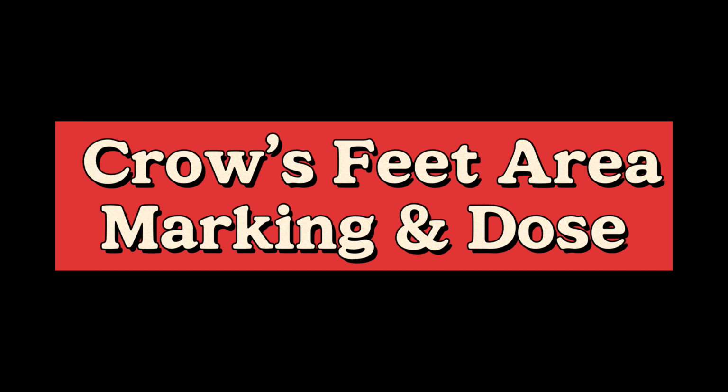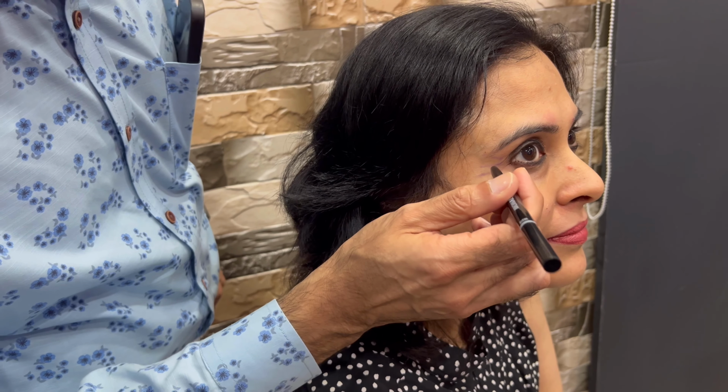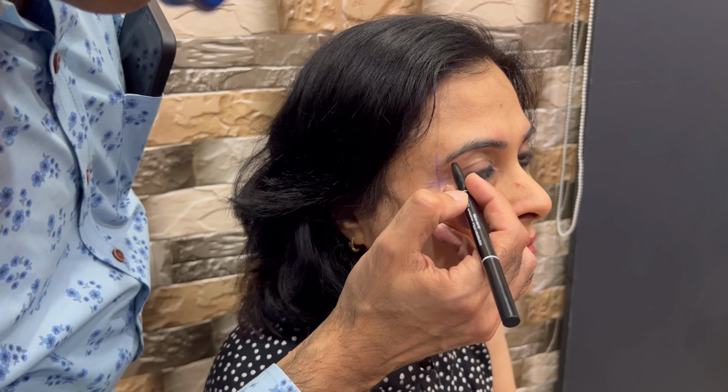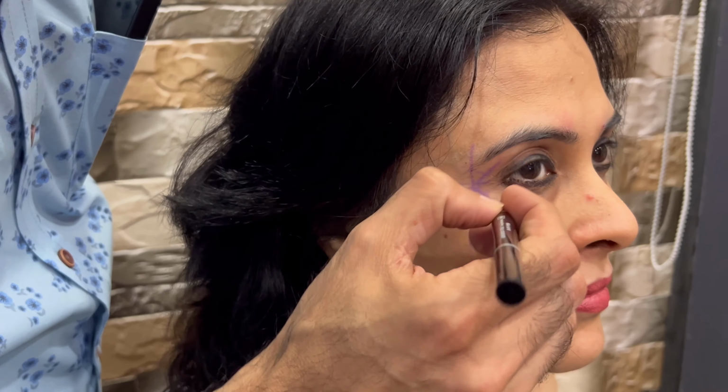So far okay? Okay, so now we have done 20 units. Right, so that's the crow's feet area. Now how do you treat the crow's feet? Remember, we said 3 centimeter. You can use a scale to measure, and mark a point right in the middle, which is 1.5 centimeter. Then you draw a vertical line from that point. Then mark a 30-degree angle in this direction and a 30-degree angle in this direction. Then go 1 centimeter here and 1 centimeter here.